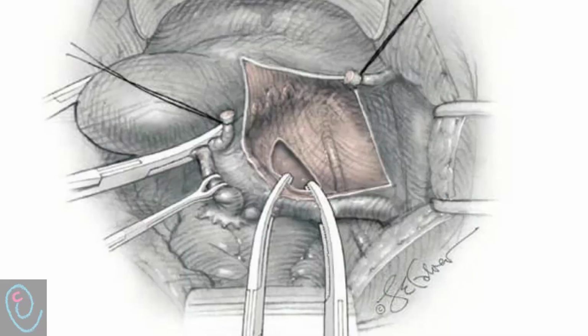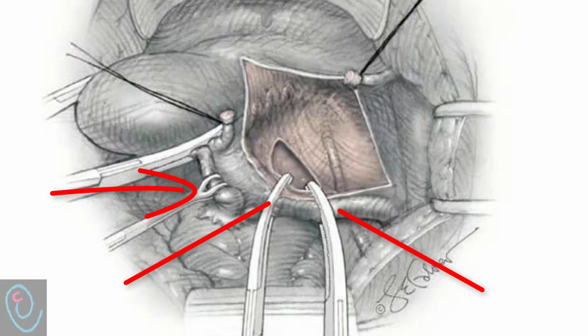Step number 8. Adnexectomy. If removal of the ovary is planned, then the fallopian tube and the ovary are grasped with a Babcock or other atraumatic clamp and elevated medially to place the infundibulopelvic ligament on mild tension. Two clamps are placed around the infundibulopelvic ligament through the window created in the posterior leaf of the broad ligament. The ligament is sharply transected between the two clamps.